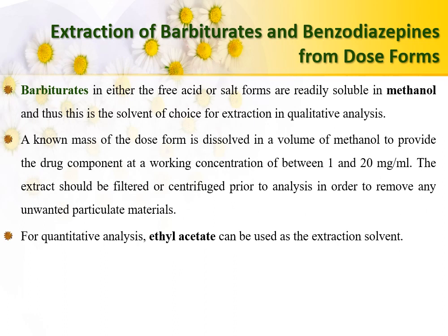The extraction of barbiturates and benzodiazepines from the dosage forms can be achieved in suitable organic solvents. The barbiturate in either the free acid or the salt form is readily soluble in methanol, and thus this is the solvent of choice for the extraction in qualitative analysis.